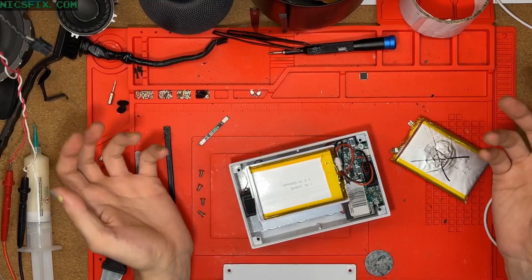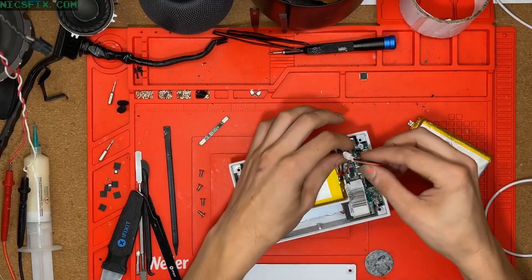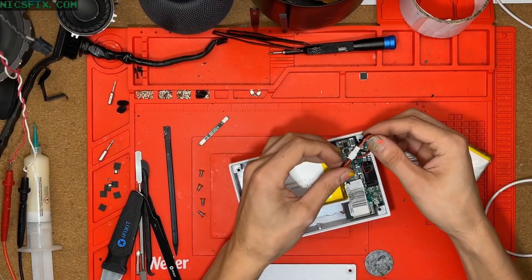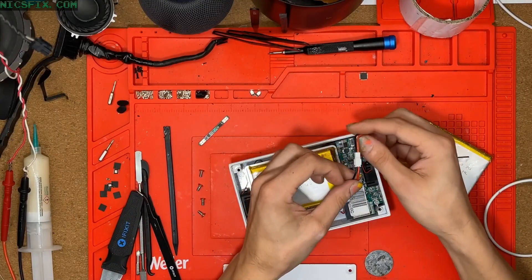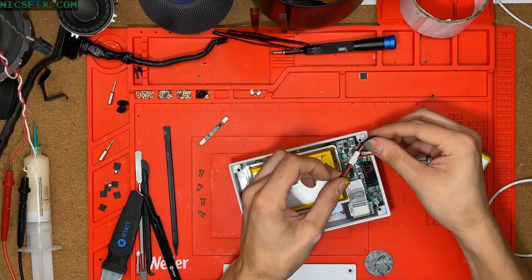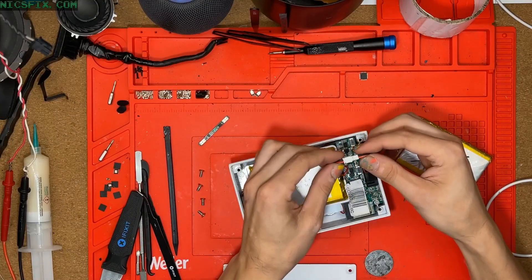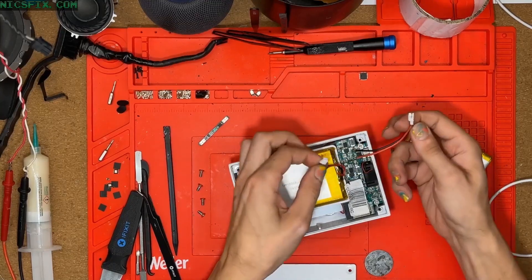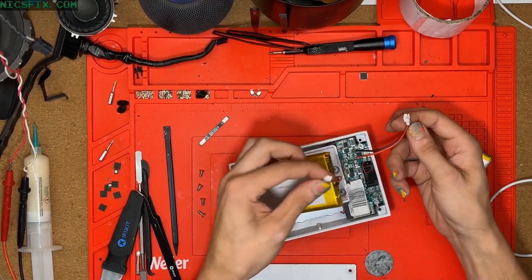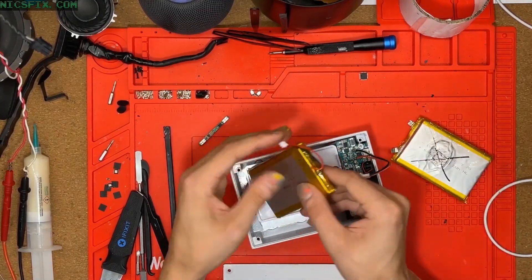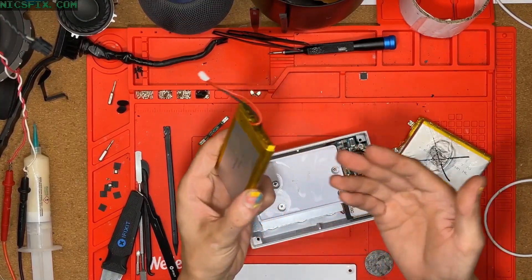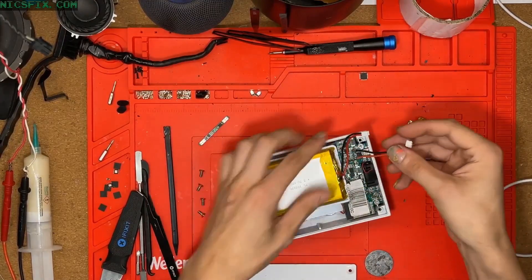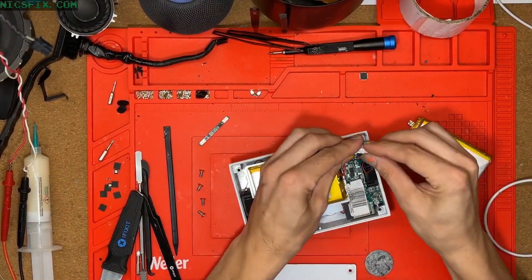While we were at it, we added a standard JST female connector to the Juve device, so that in the future, if the battery ever needs to be replaced again, they can easily disconnect it and plug in a new one.